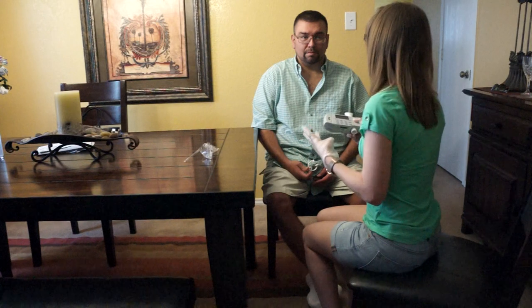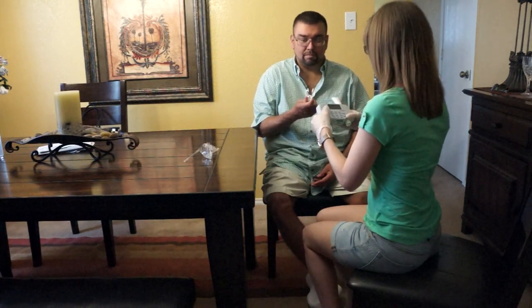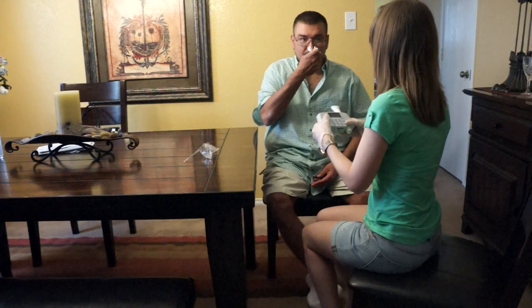Okay, now if you give me 3 good tries, that's all we need. We can get up to 8, but you want to do your best effort in the first 3 before we have to move on to the others, okay? Because if we get 3 good ones, then that's all we have to do. All right. Go ahead and put your nose clips on.